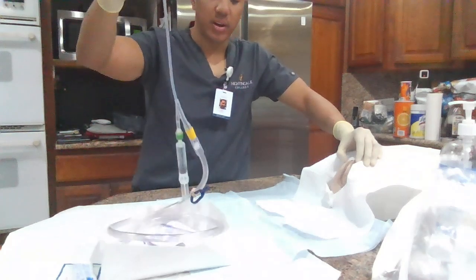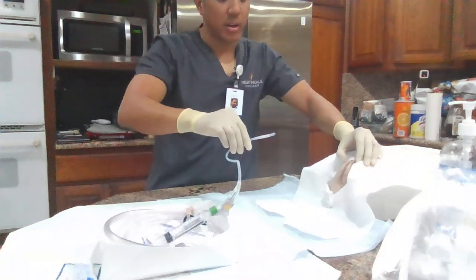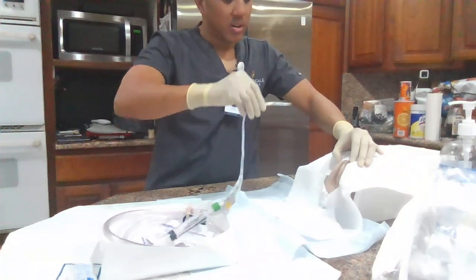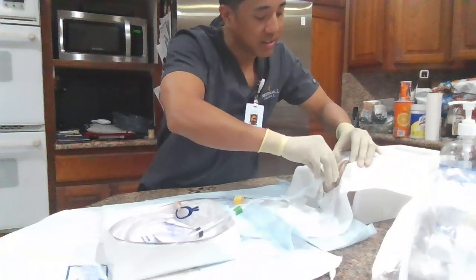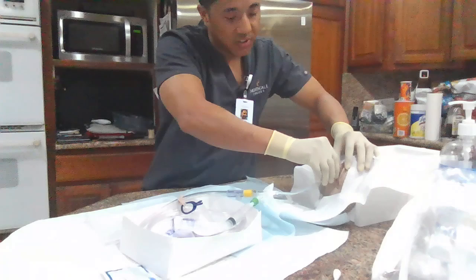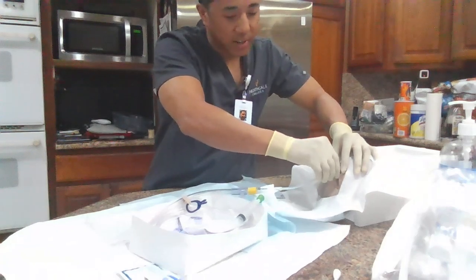All right, Mrs. Smith, before I enter, I want you to take a nice big deep breath for me. And as you exhale, I'm going to insert the catheter for you, okay? So deep breaths in and deep breaths out. Okay, I'm going to advance the catheter 2 to 3 inches in, and I'm going to visualize for any urine flowing into the catheter.